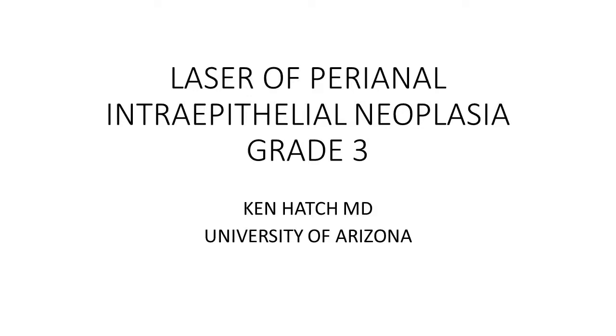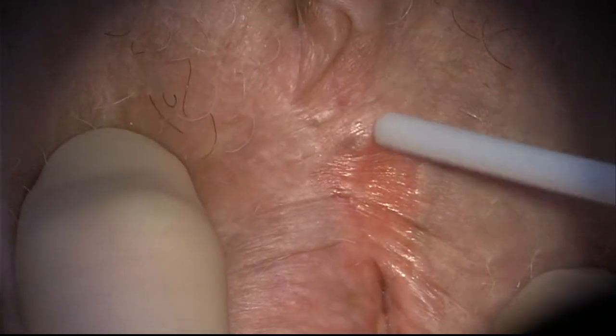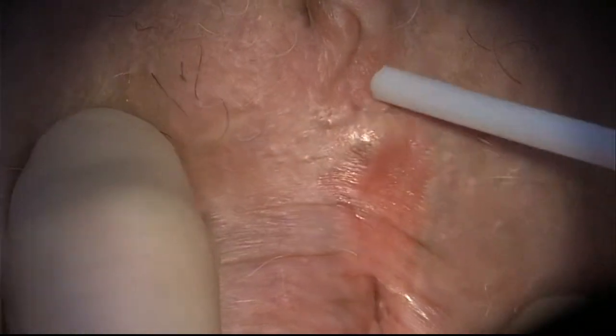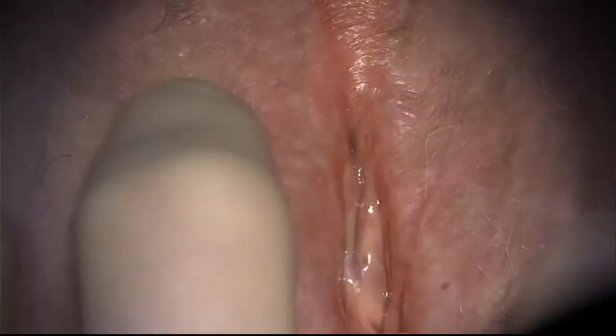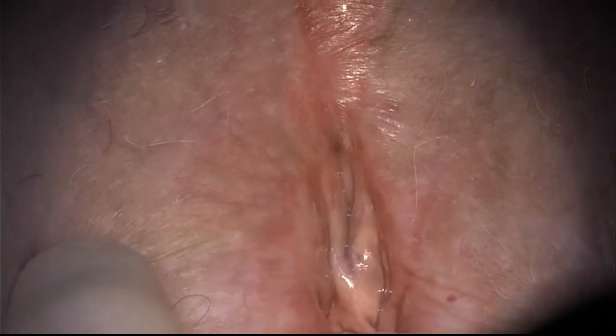This video will show a laser treatment of perianal intraepithelial neoplasia grade 3 at the University of Arizona. The patient has previously had CIS of the vulva and has had both labia minora removed. The clitoris has been spared and the urethra is normal.